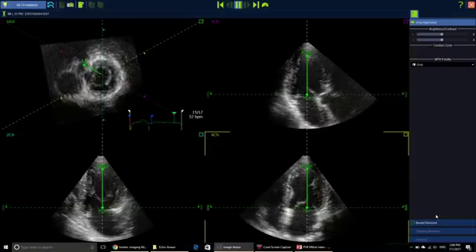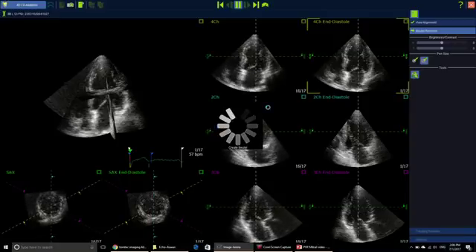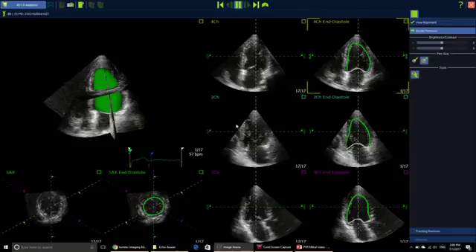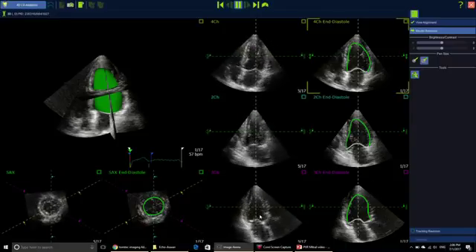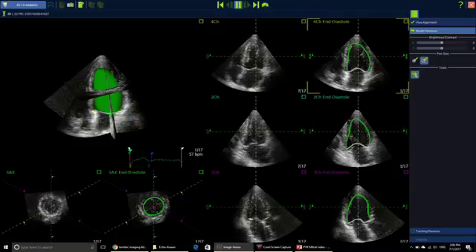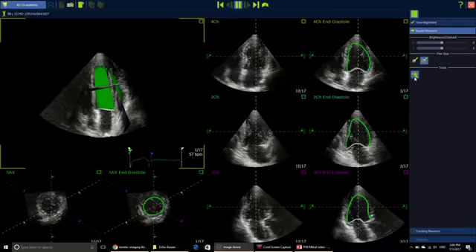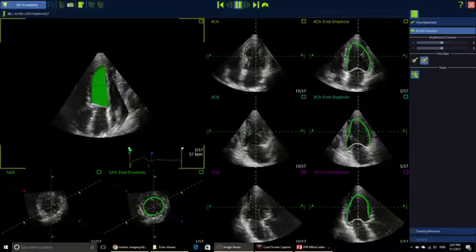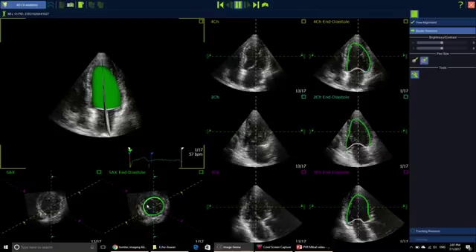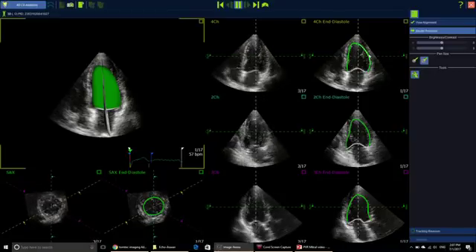If you are satisfied, you can just click 'View Til Revision' — one left click. Once you open it, some tracking will happen, and then it will give you a still frame at end diastole. Here is the dynamic series and here is the volume or the end-diastolic cast. If you need to remove the black and white, you just click here — it will give you the cast without black and white. Click it again and it will give you the black-and-white volume again plus the cast. Here is also the short axis at end diastole with a dynamic image. Here you can edit anything you want — if the tracking is okay, well and good; otherwise you can edit very easily.